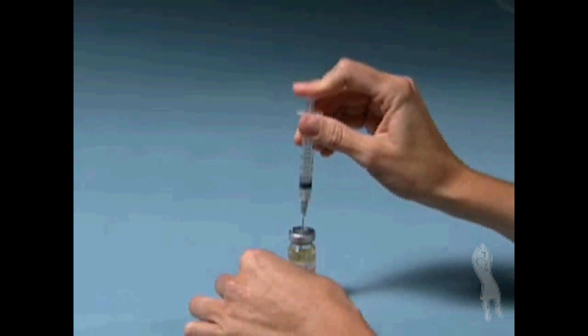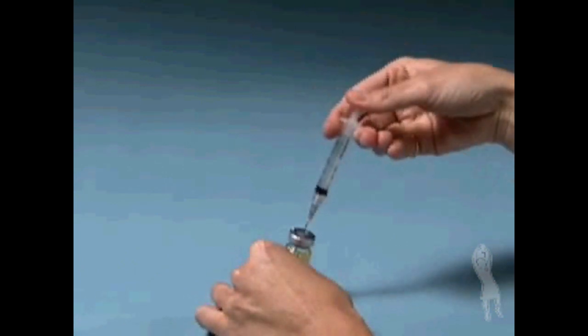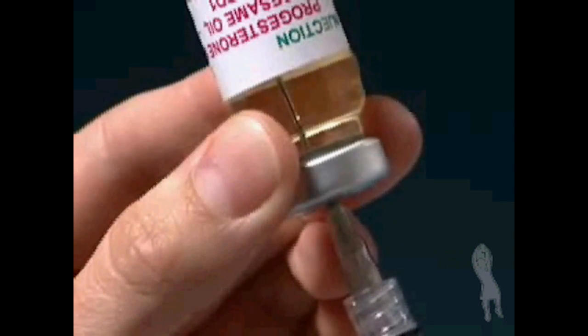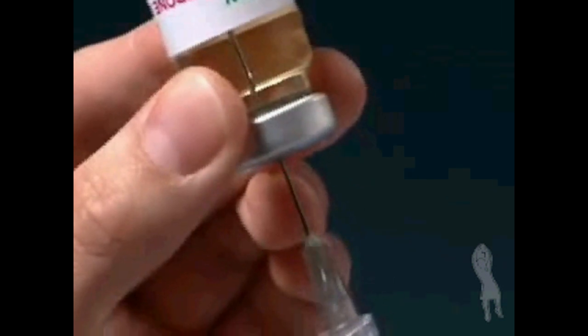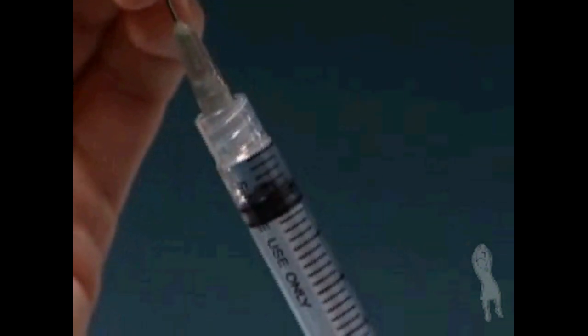Gently press on the syringe plunger — this will allow air to enter the vial, which makes withdrawing the solution easier. Without removing the needle, invert the vial and slowly pull back the plunger as far as needed to withdraw the milliliter/cc dose of progesterone in oil that you've been instructed to take. Make sure the tip of the needle remains in the liquid.